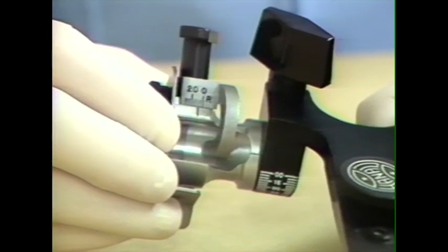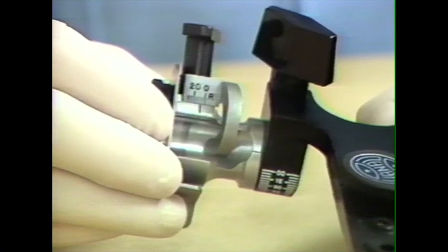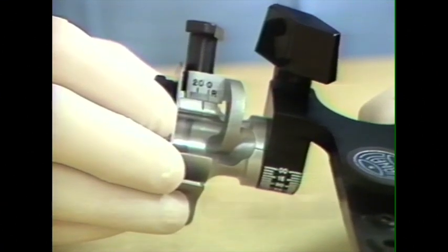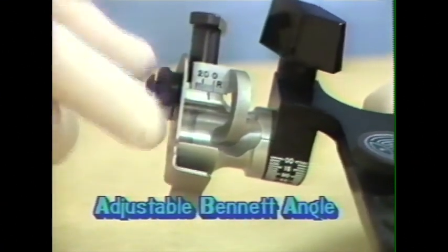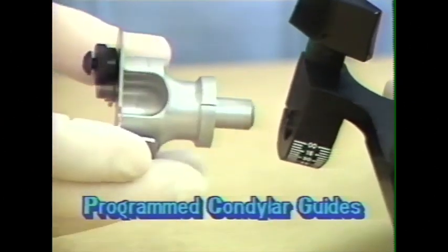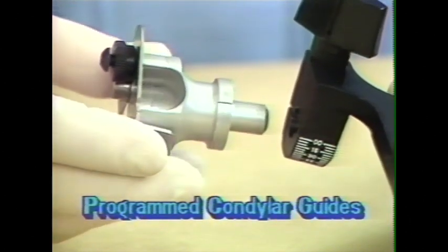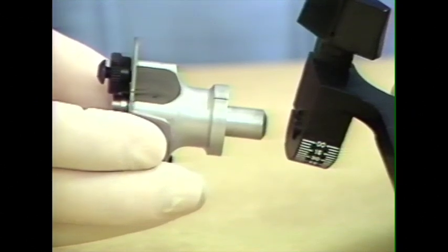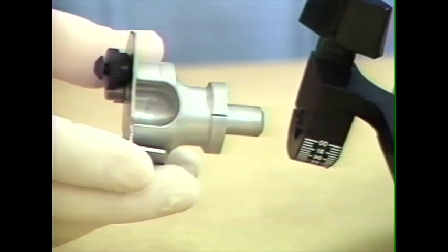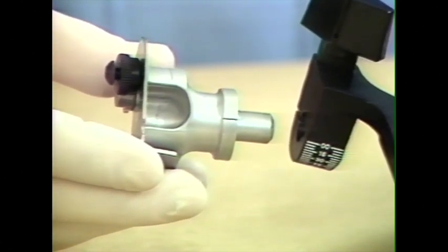There are 4 types of fossa elements available for the Hanau Modular Articulator. The one that we have illustrated before is the one with the adjustable Bennett angle. The second type that is available is the programmed fossa, in which a certain degree of Bennett immediate side shift has been programmed into the fossa element. There are various choices of curvatures and immediate side shifts available with this element.